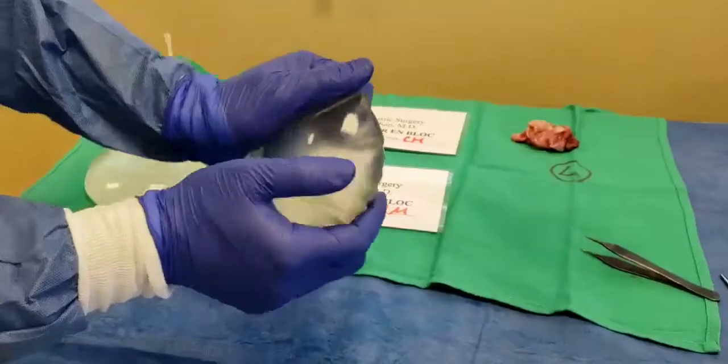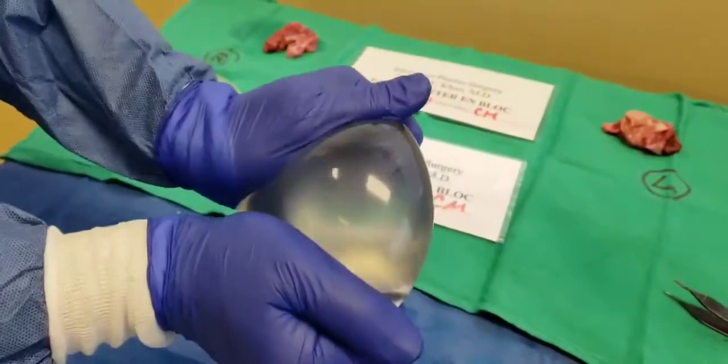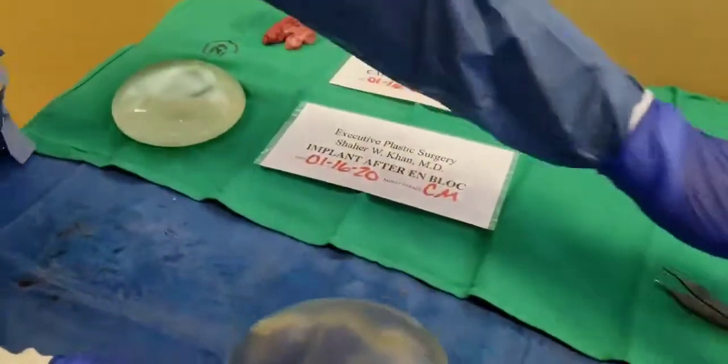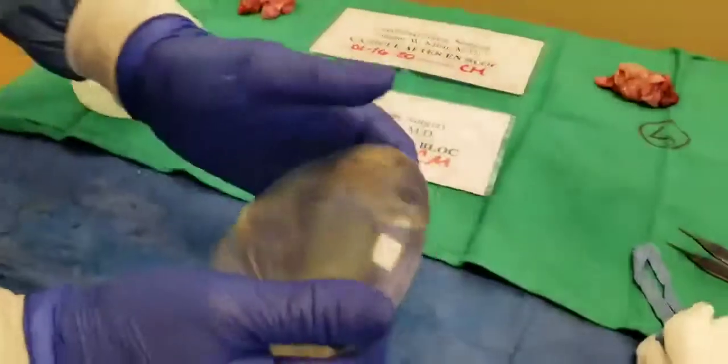Now what I'm going to do is show you I'm checking for any abnormality or leak. And as you can see right here, there actually is a small, very small leak that I just noticed when I pressed right here.